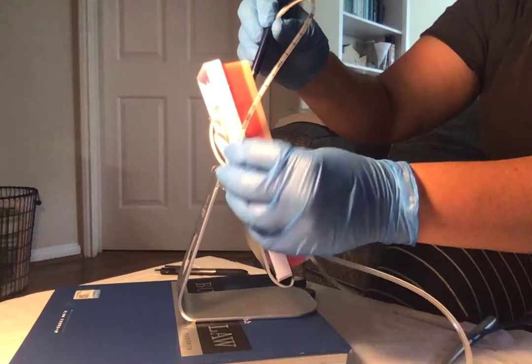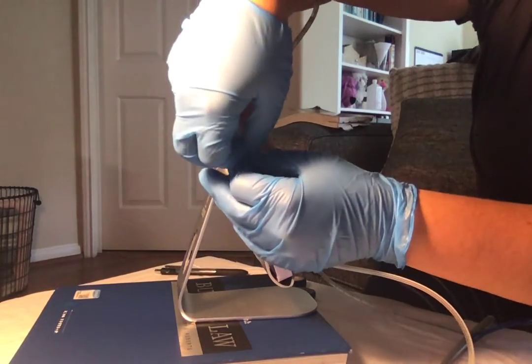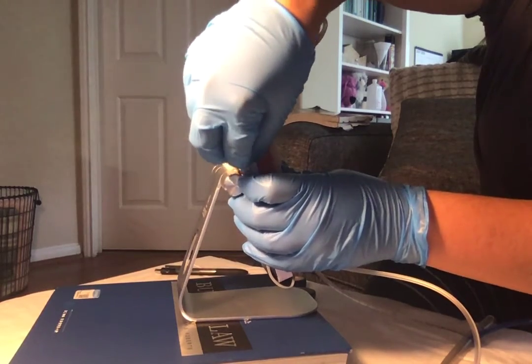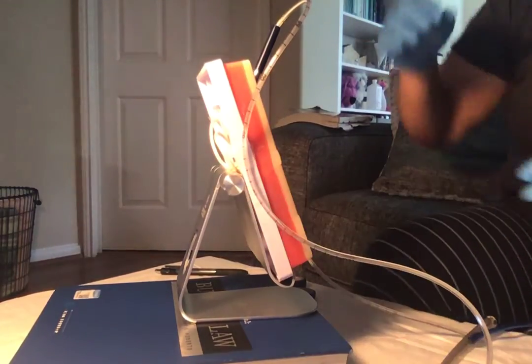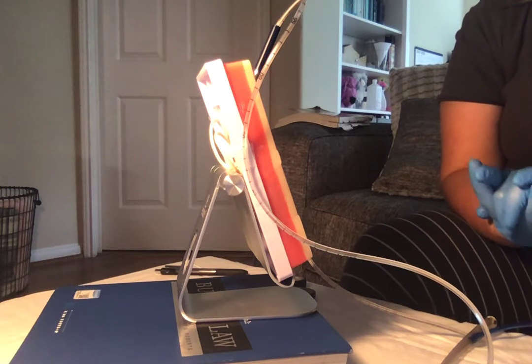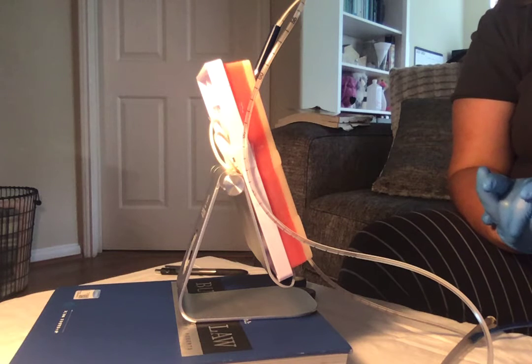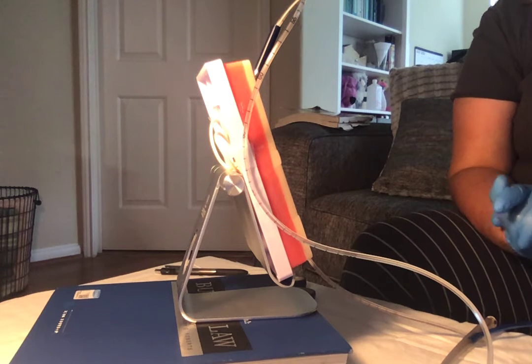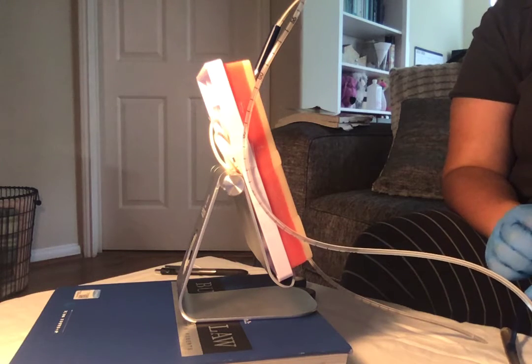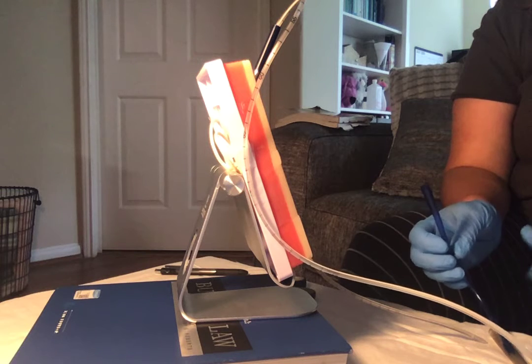I'm then going to temporarily tape the tube to the patient's cheek. And we're going to then check the placement of the tube and ask the patient to speak. I'm going to inspect the posterior pharynx for presence of coiled tube. We will attach the catheter tip syringe at the end of the tube and aspirate gently back on the syringe to obtain gastric contents and observe color.